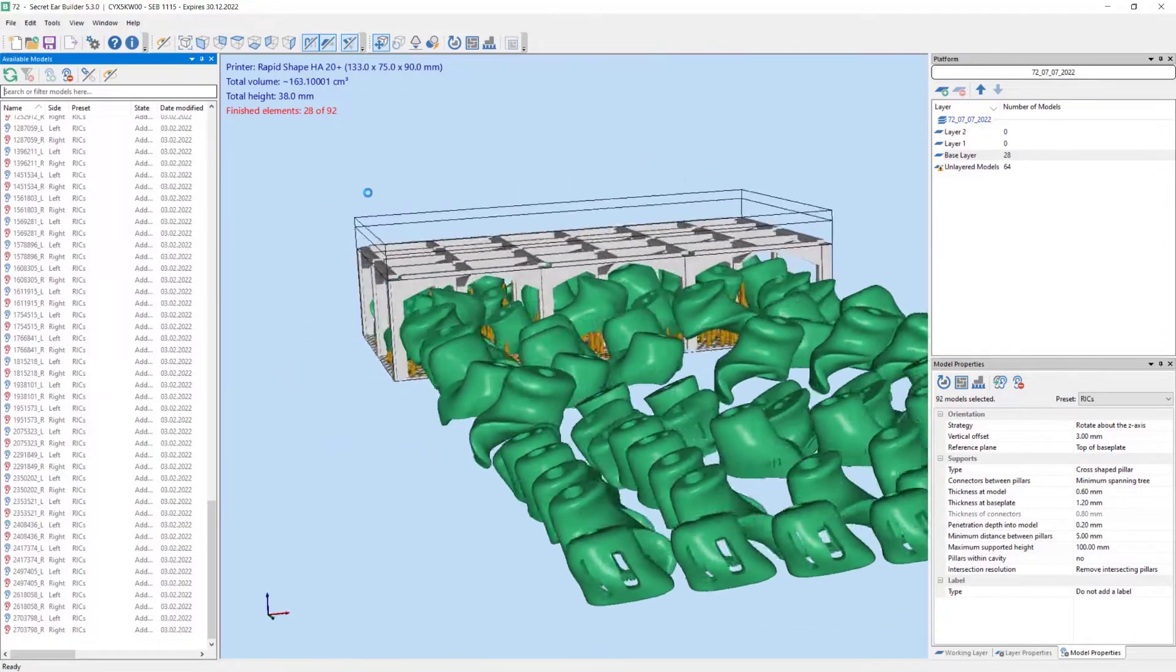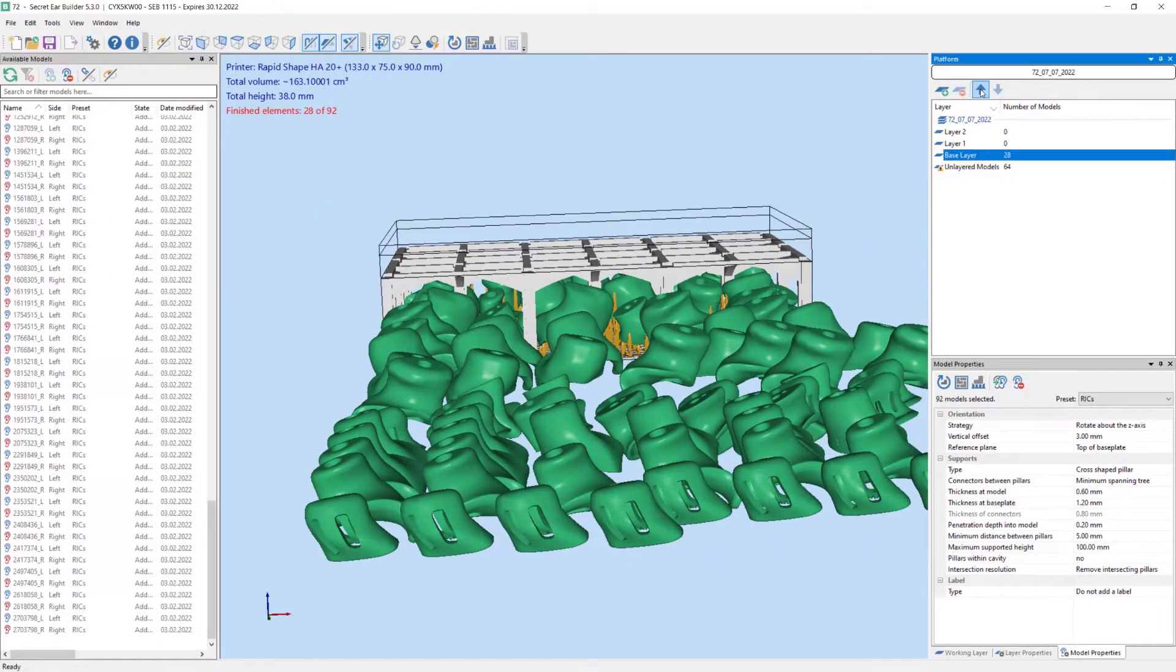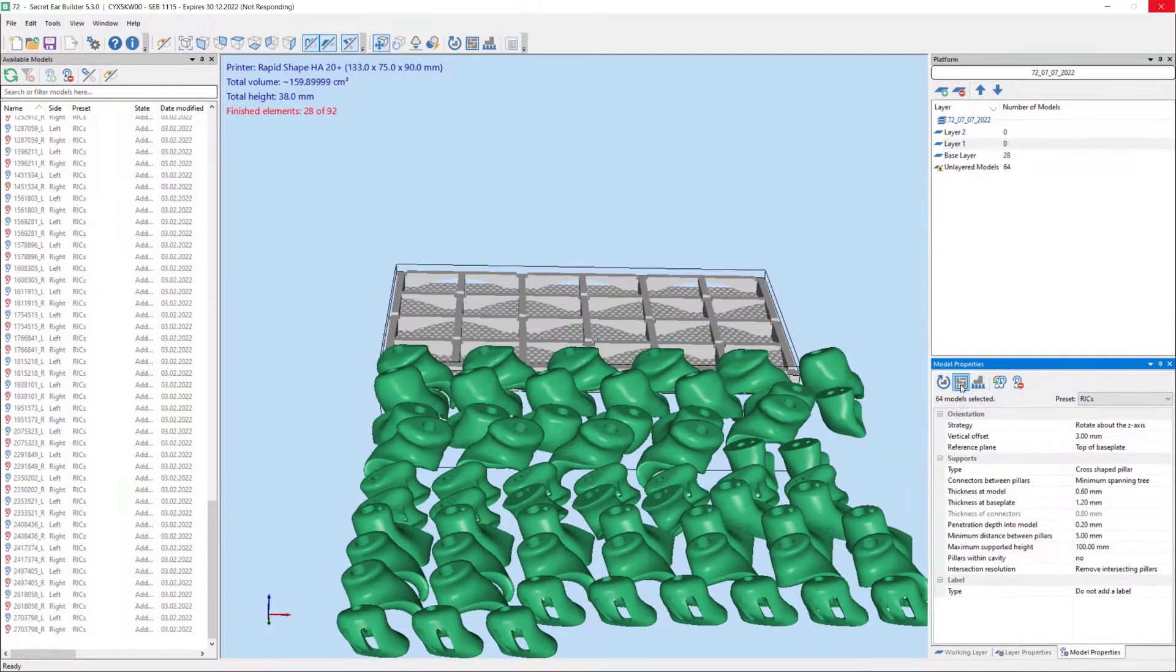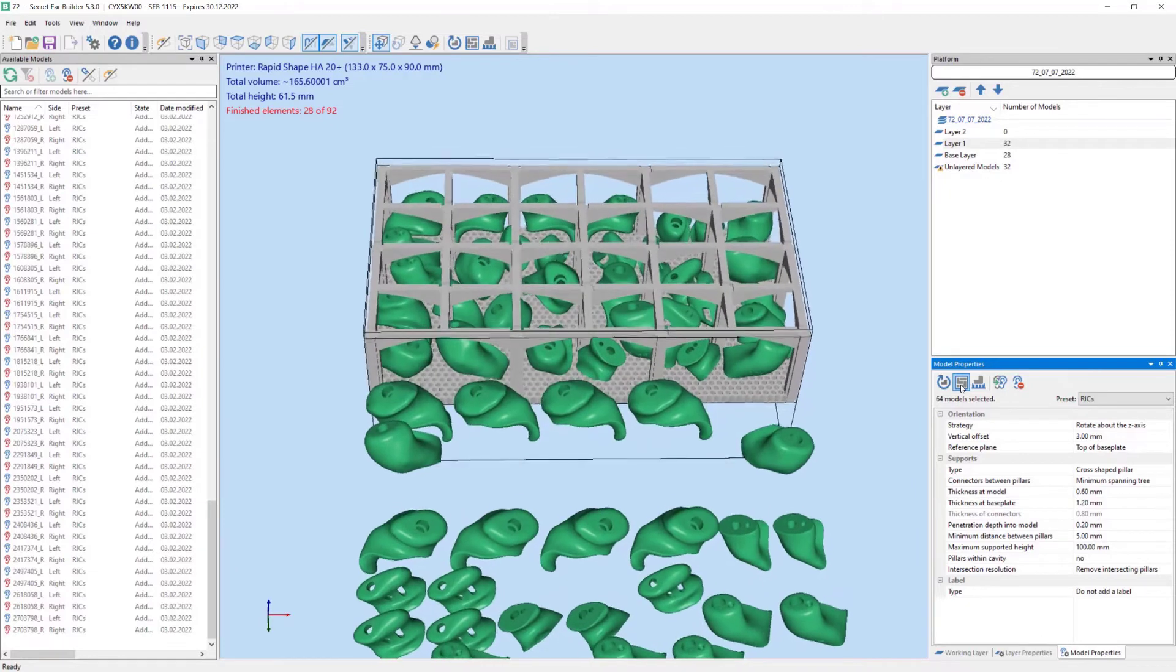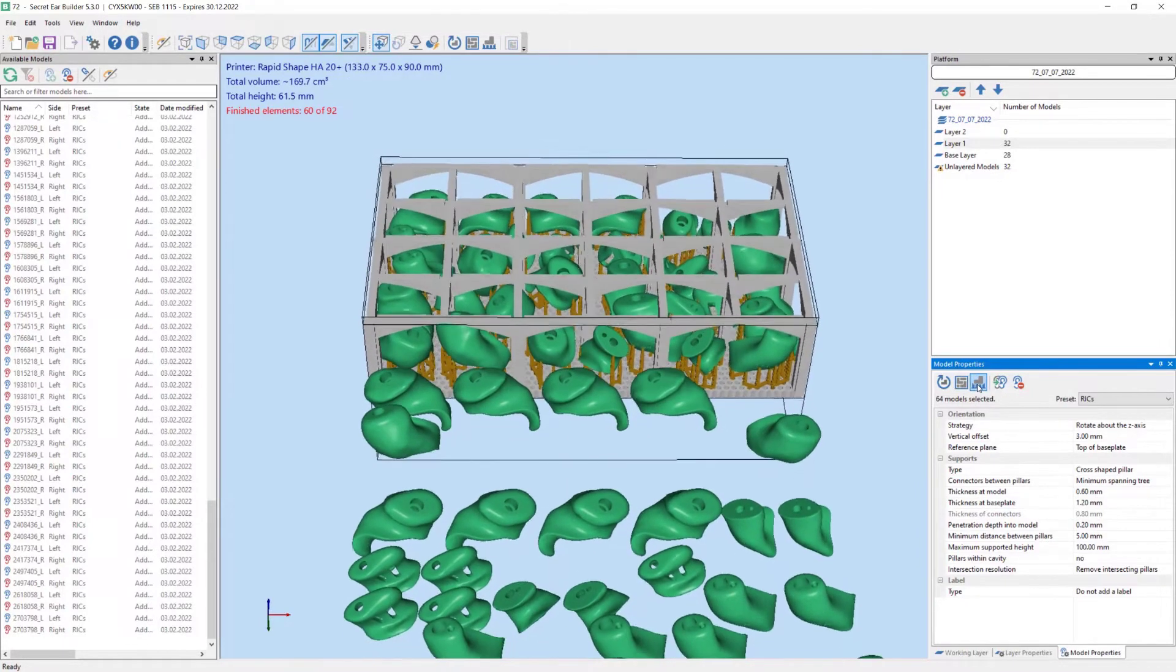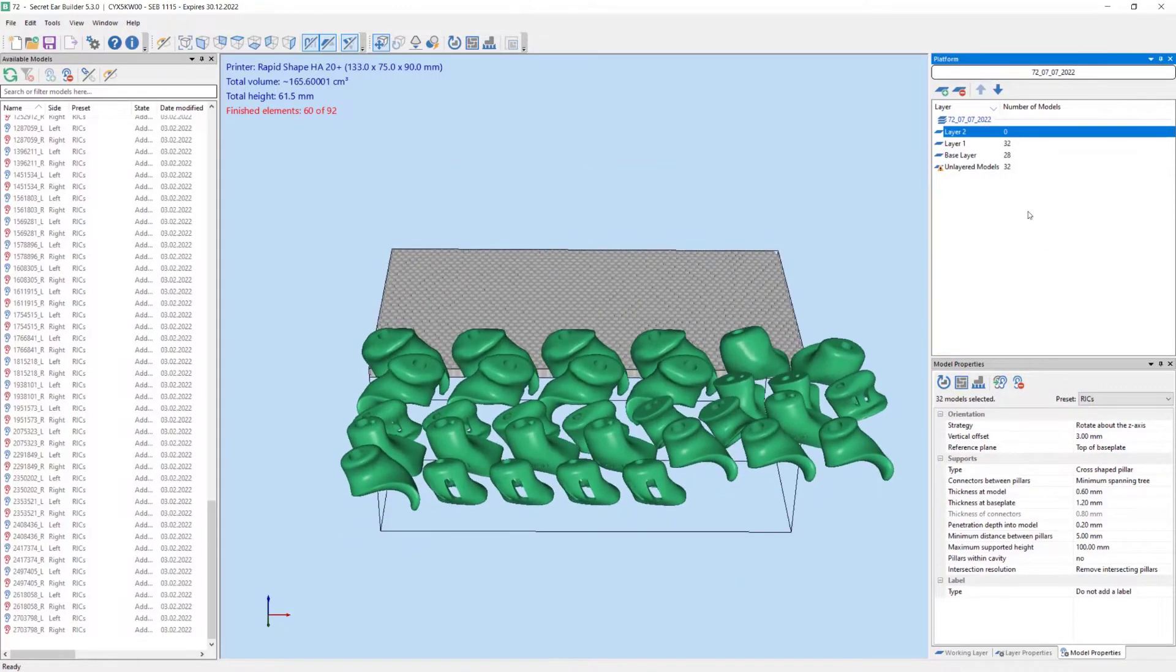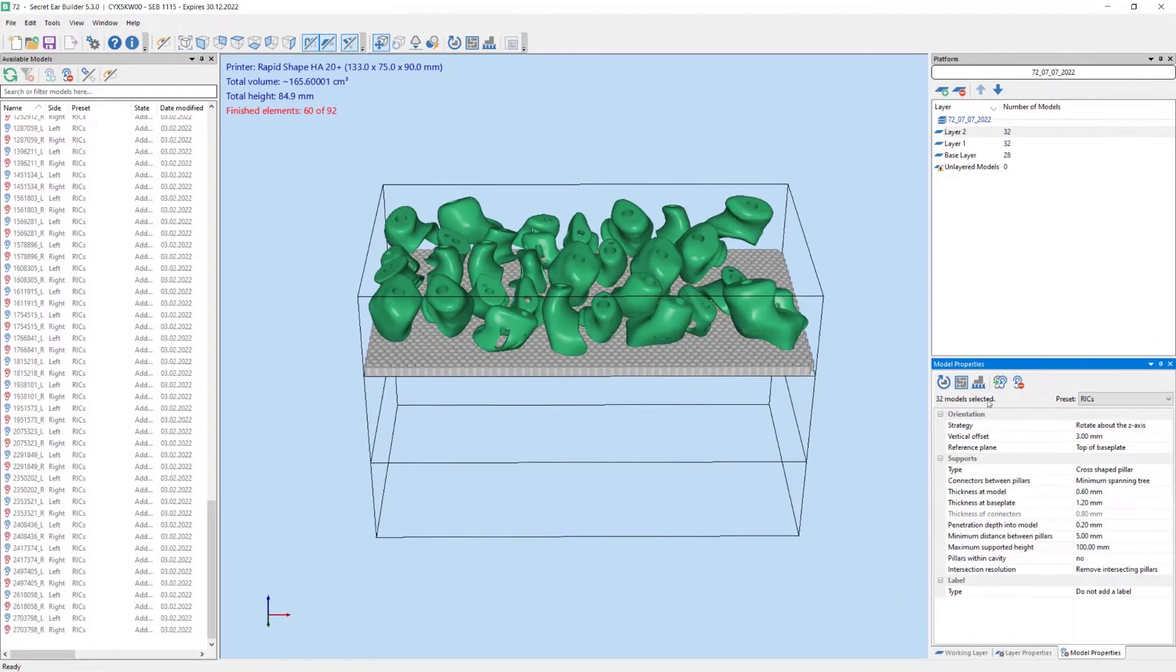We switch to the next layer and a further maximum number of rigs is automatically added and nested. By clicking the add supports button we add support structures. Now the top layer is activated. We again nest the ear mold models and add support structures.